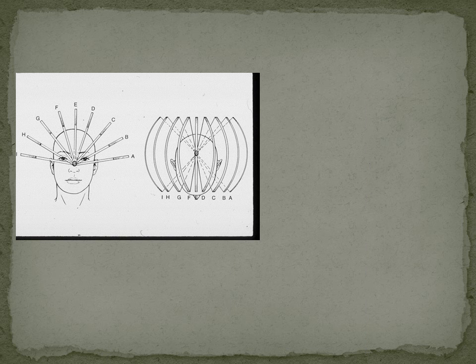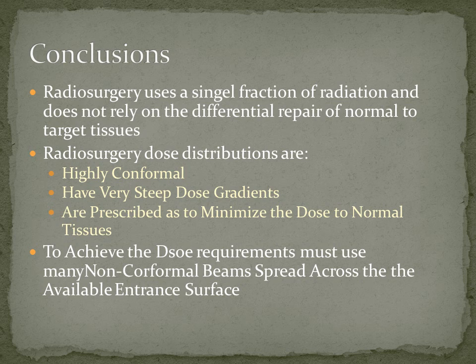We will often start with a 9-arc set. I remember I said we use about 500 degrees of arc. When we use a 9-arc set, we do that because it's just easier to start with 9 and eliminate sometimes than it is to start with 5 and rearrange. So our normal sphere packing set is 5 arcs using about 500 degrees, and we'll use a 9-arc set when we want to eliminate things. So you'll see us do that with the planning system.